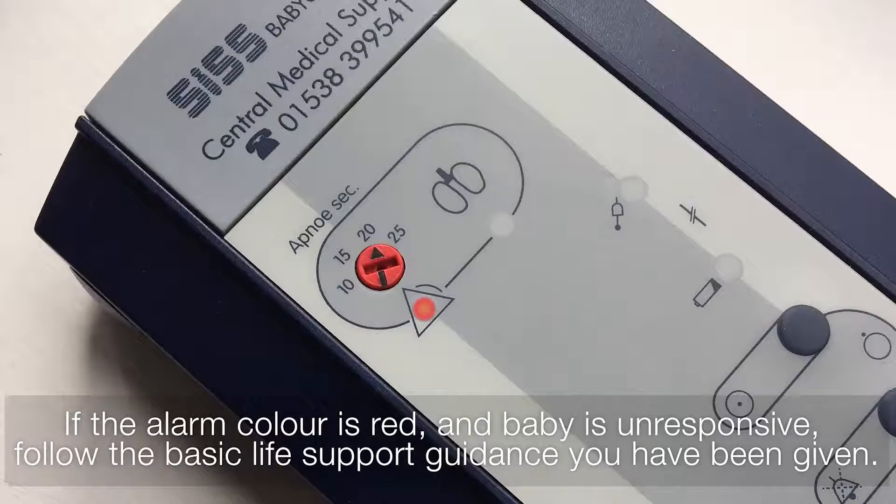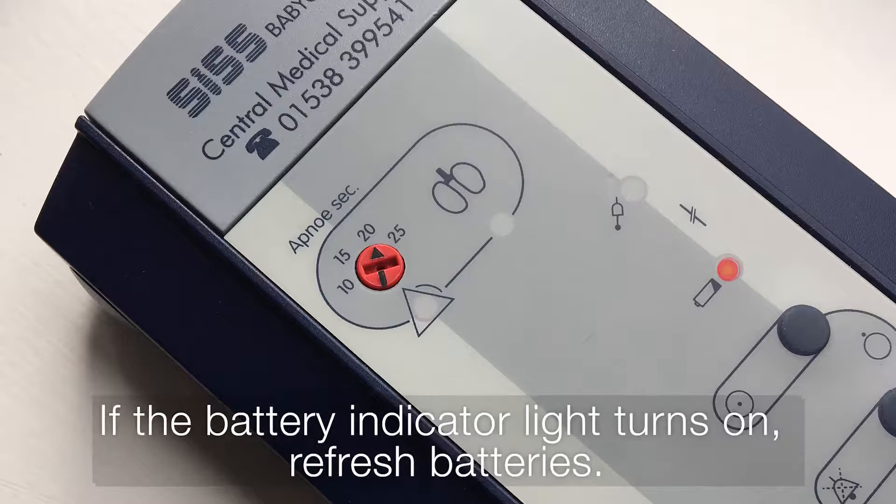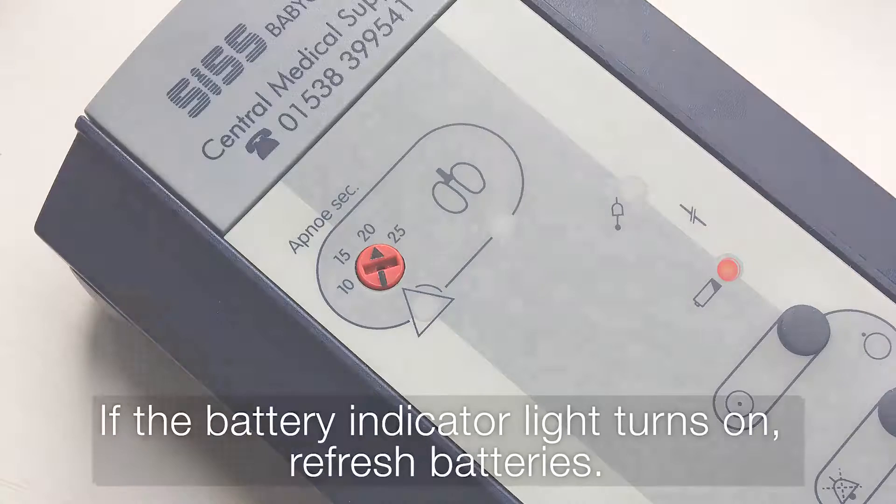Should the monitor alarm, look at your baby. If the alarm colour is red and the baby is unresponsive, follow the basic life support guidance you have been given. If the colour of the alarm is orange, check the connection of the sensor. If the battery indicator light turns on, refresh batteries.